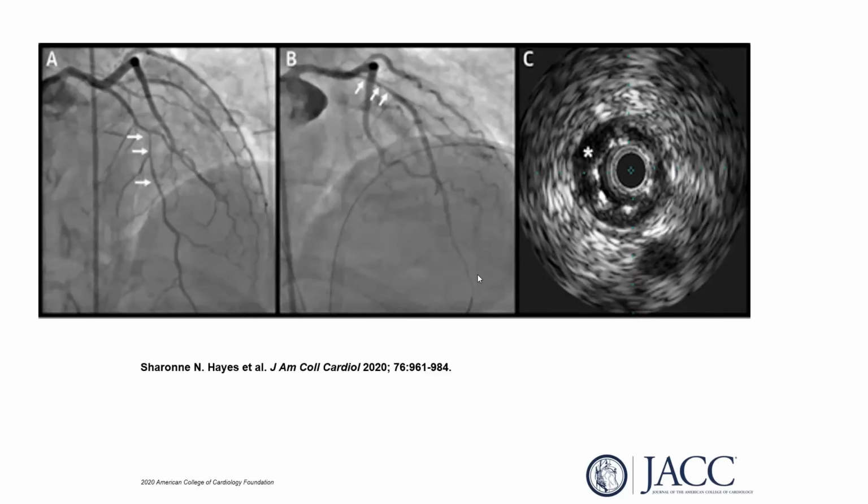This is the so-called late stent malapposition, which is common in thrombotic STEMI after the thrombus resolves and dissolves behind the stent, but it is more prevalent and more dramatic in SCAD. So late stent malapposition. So really avoid stenting as much as you can in those patients.